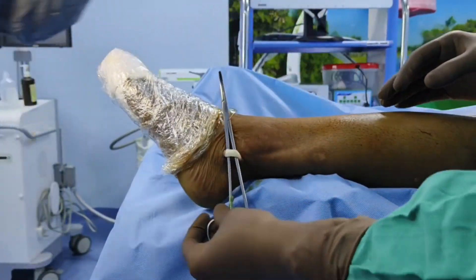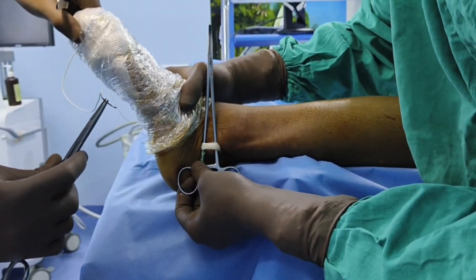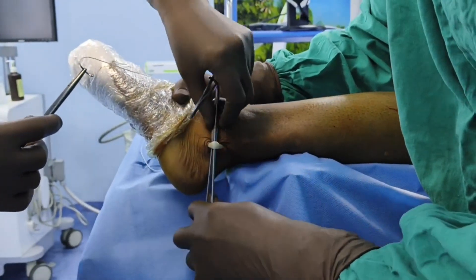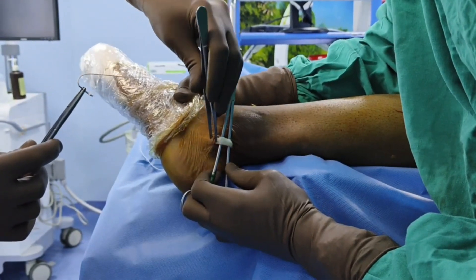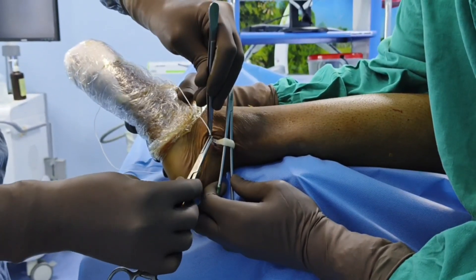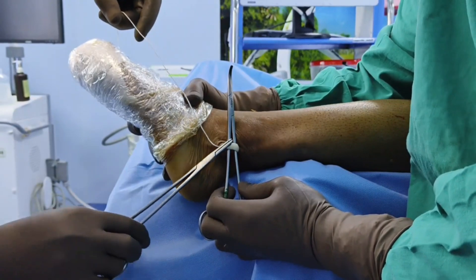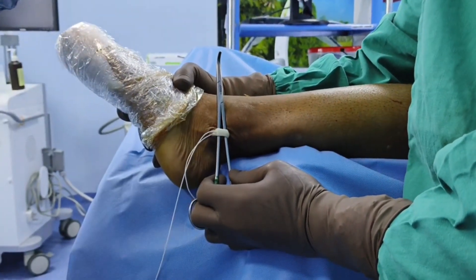Once you tie both tendons, you take the fiber wire or Ethibond suture. I usually prefer the fiber wire because it is quite strong compared to Ethibond. You take the fiber wire and pass it through the peroneus longus from one end and exit it through the middle of the tendon.